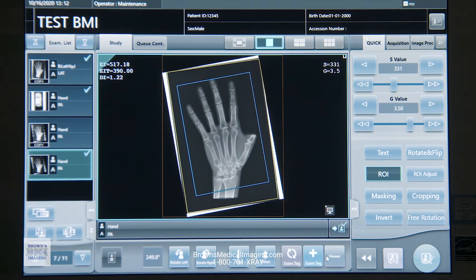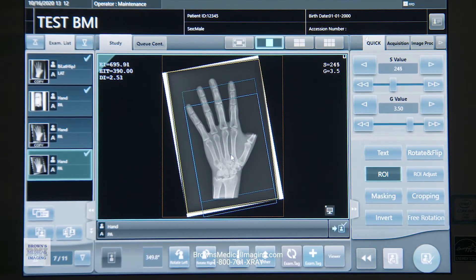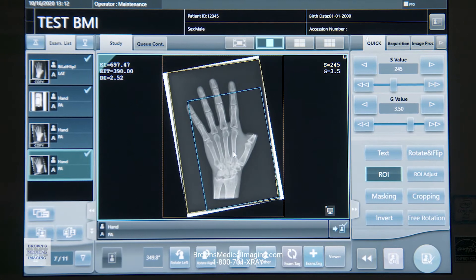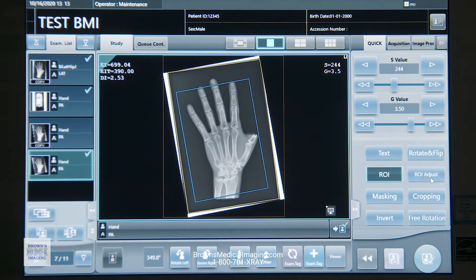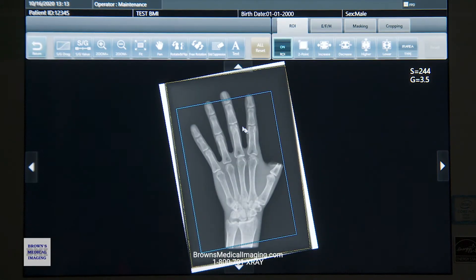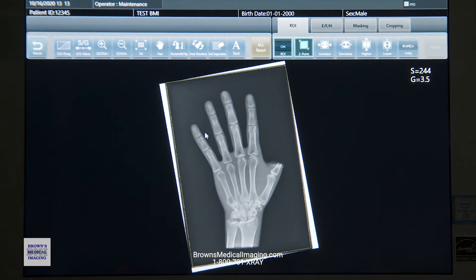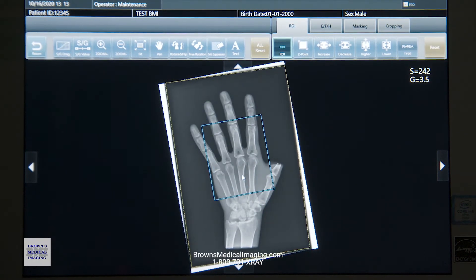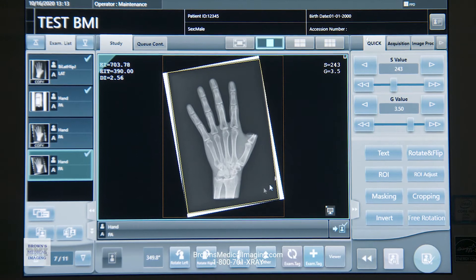ROI stands for region of interest. That little blue box pops up and wherever I click, that will be the new center of my ROI. It's going to change the density of that image as I move it around — it really just affects the brightness of the image. It's a really nice tool to use rather than window level. If you want to adjust that ROI, we can go into ROI adjust — maybe that box is a little too big and you want more fine-tune adjustments. I'll use the two-point tool to select points and make a smaller box, which makes more fine-tune adjustments to density. We'll turn that ROI off and it'll still save that image the way you adjusted the ROI.